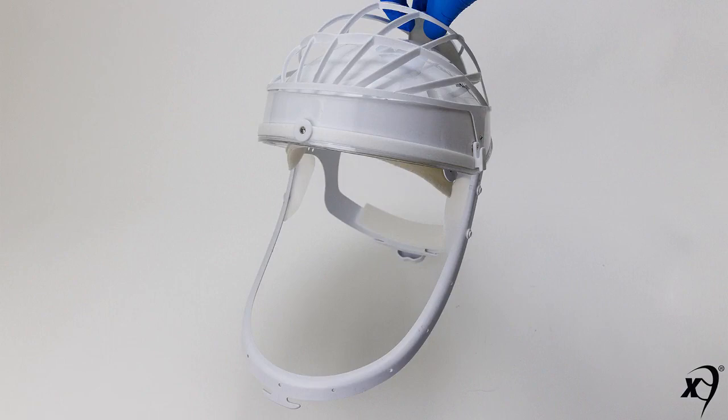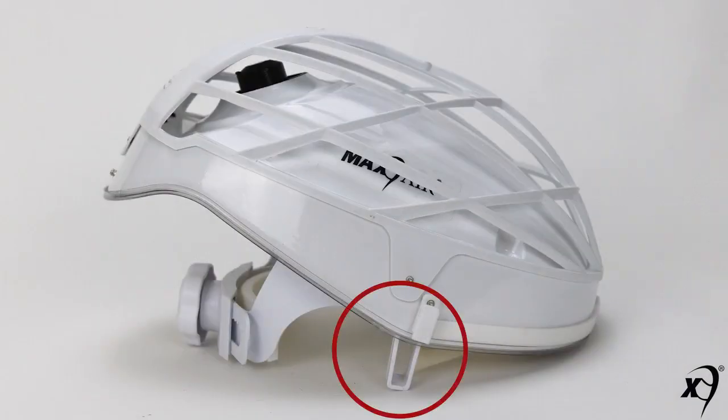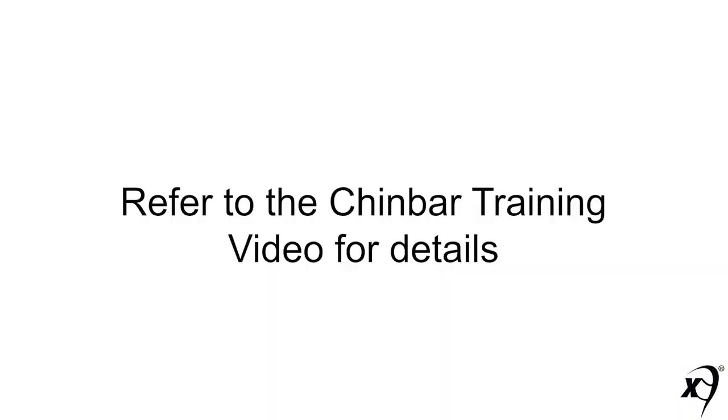The chin bar shipped with the PR helmet may be removed and replaced by standard side tabs. Refer to the chin bar training video for more details.